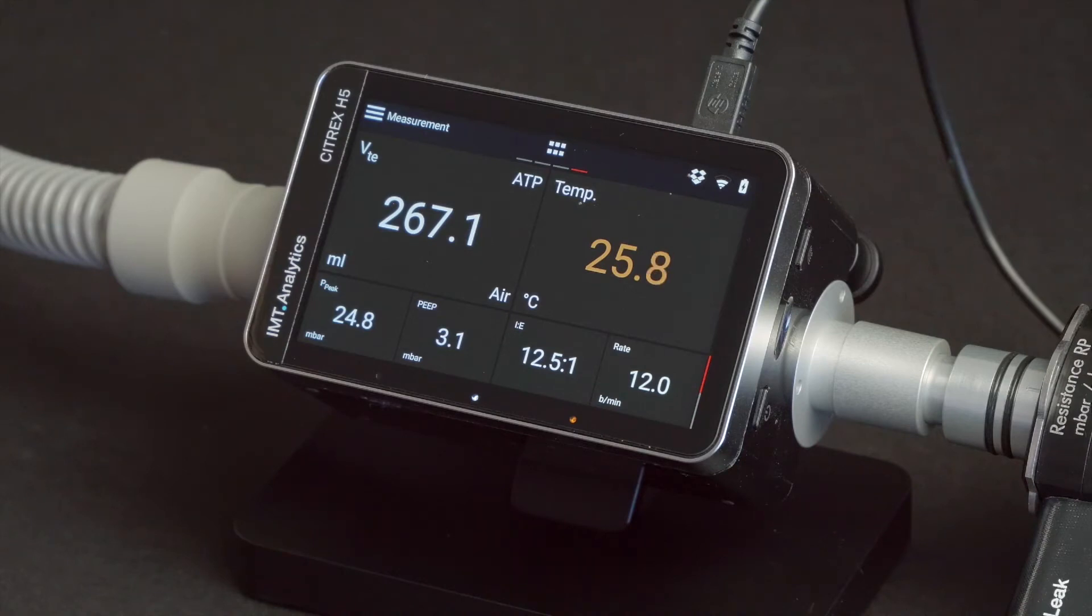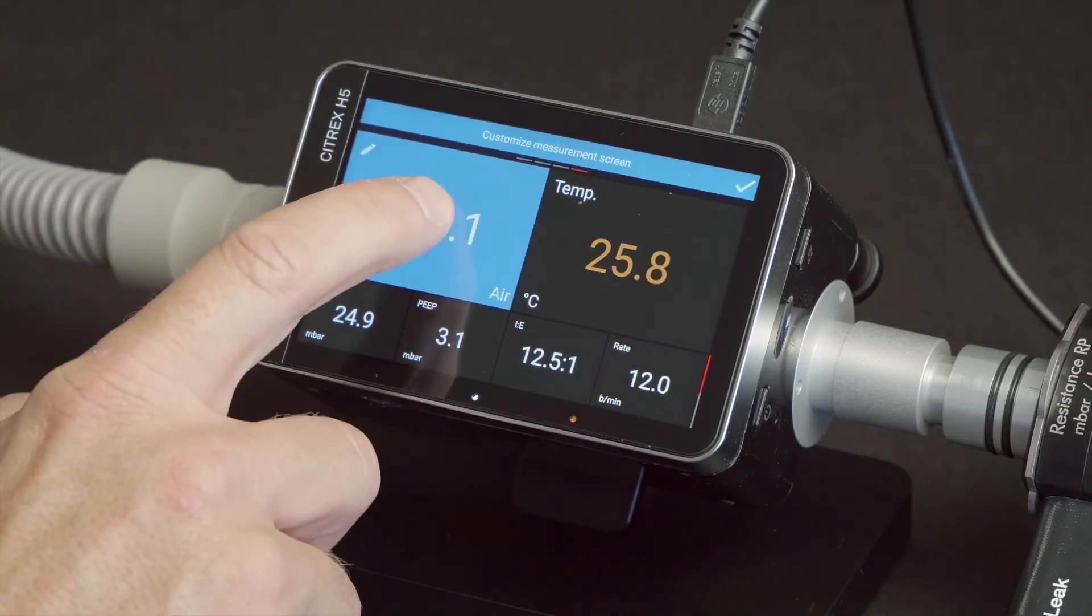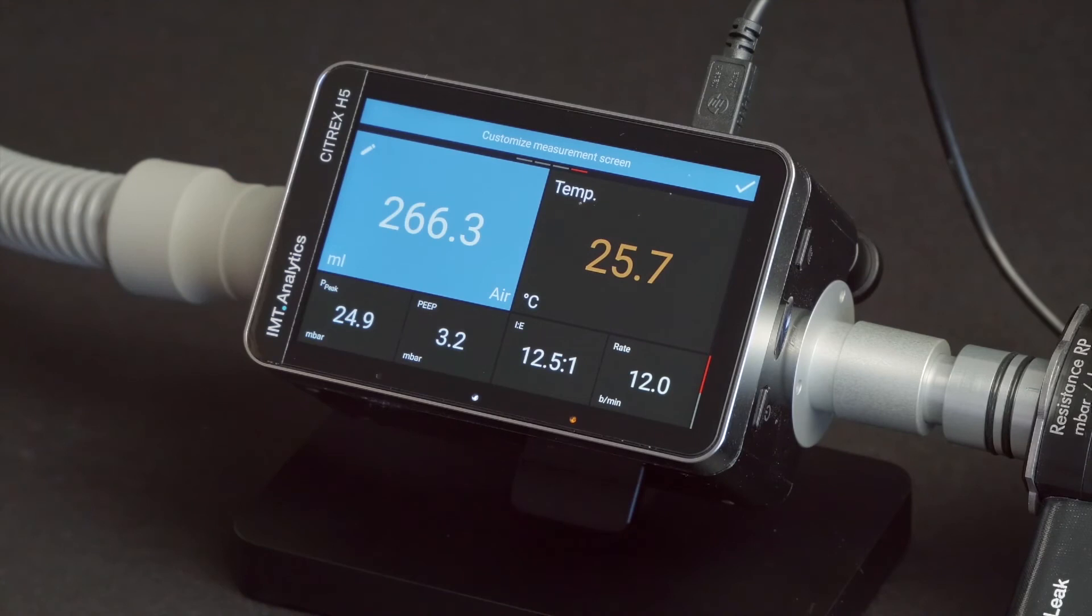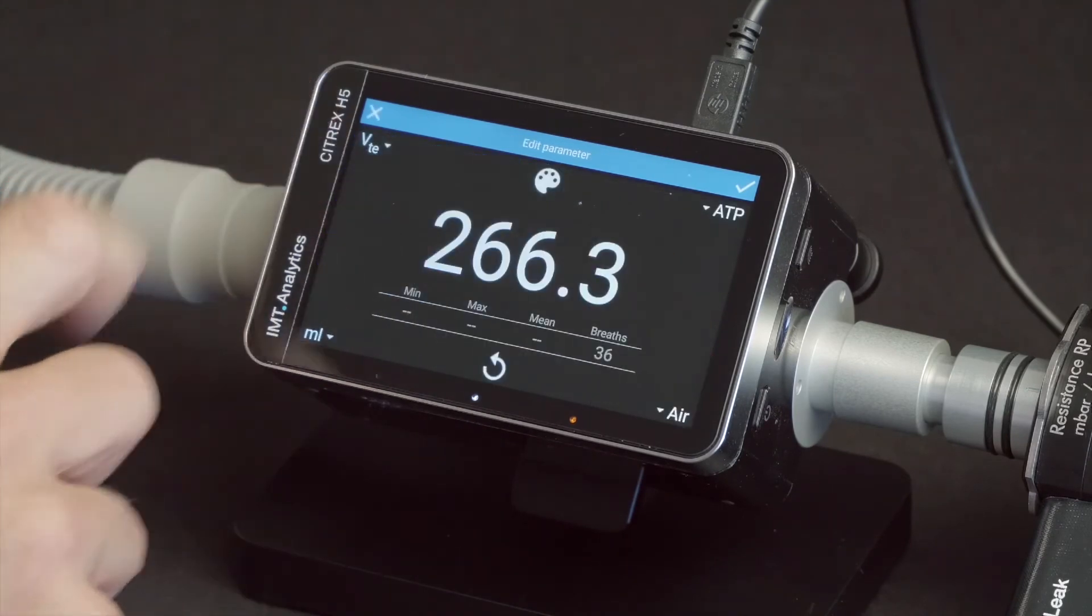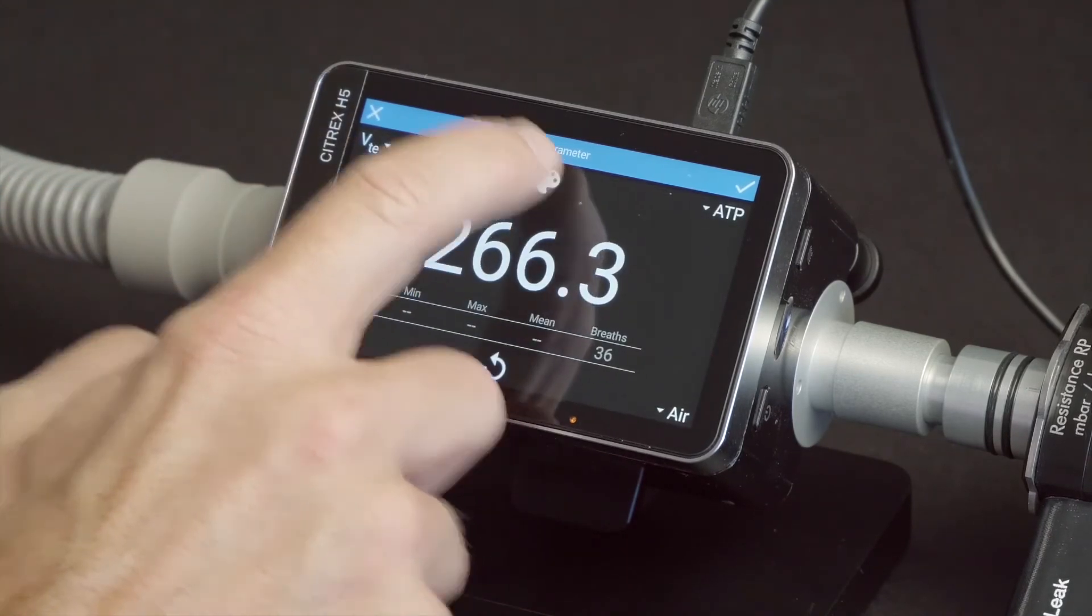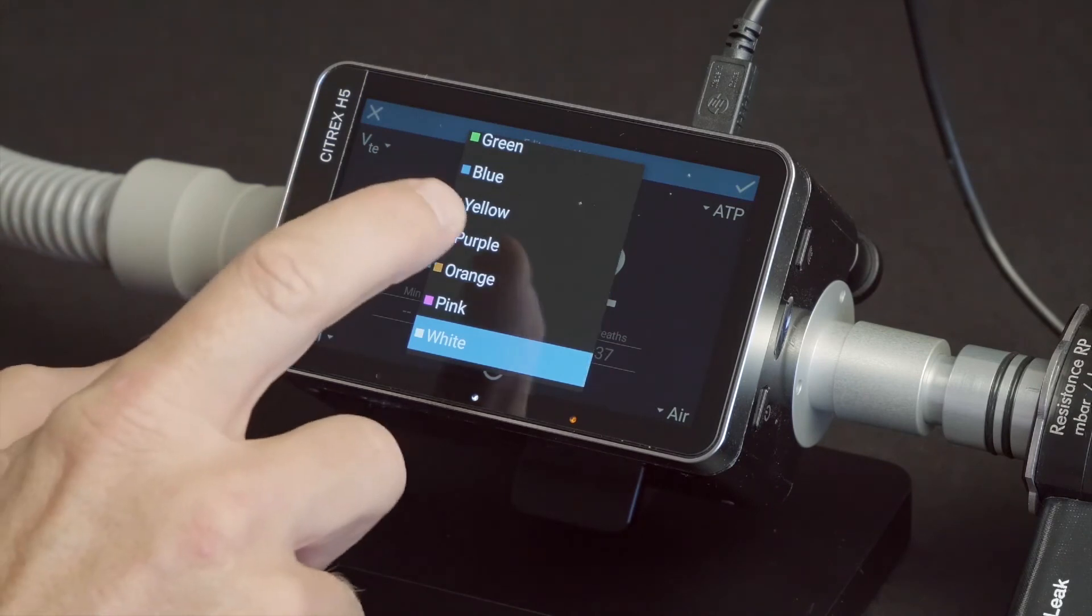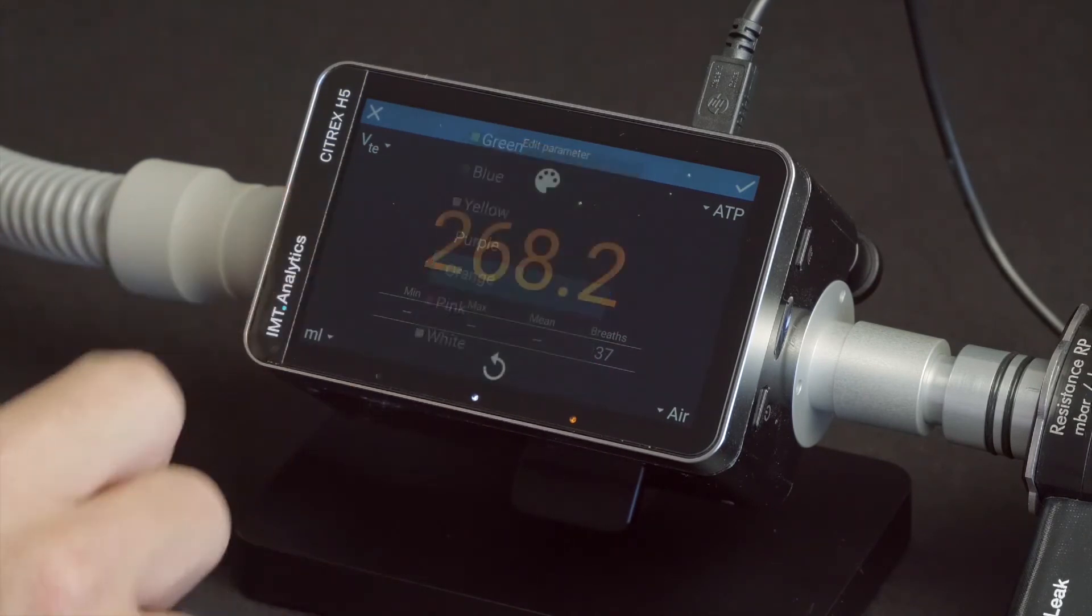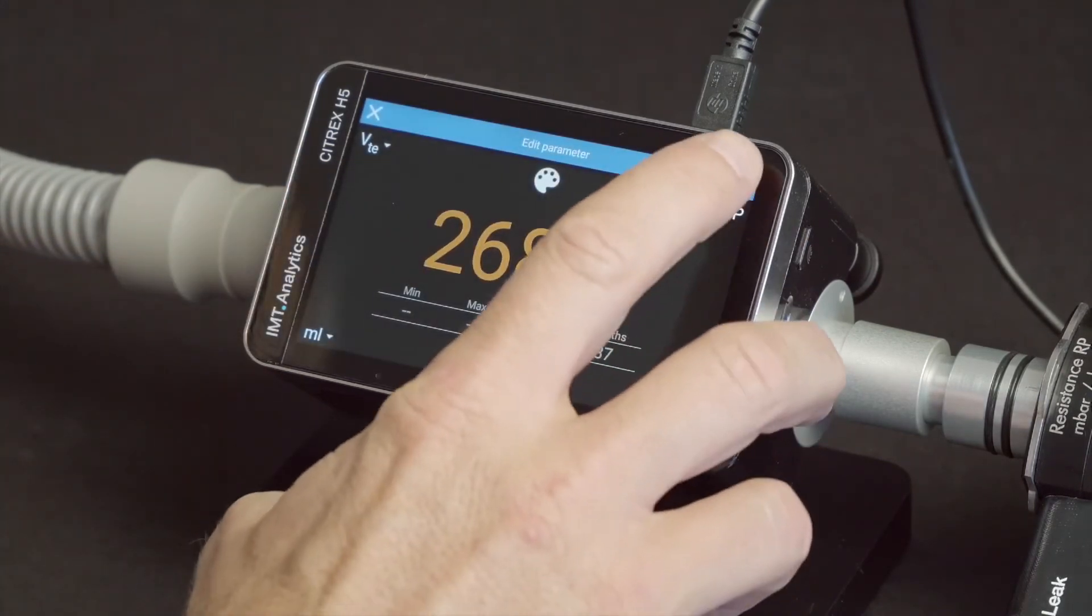For editing colors of the numerical, press and keep pressed the tile for one second. Push the edit icon and tap the color icon in the middle of the screen. Choose the color and it's confirmed with the tick.